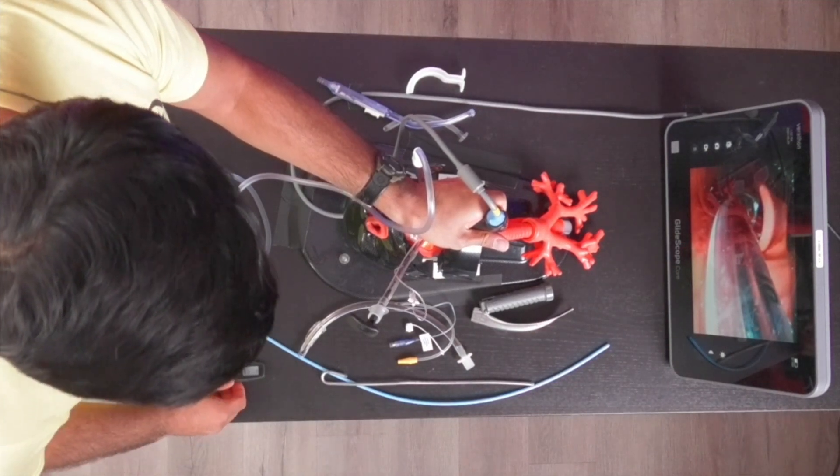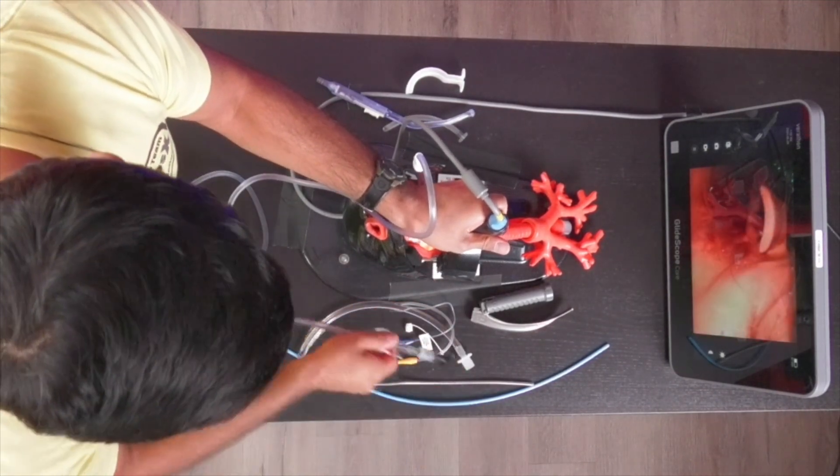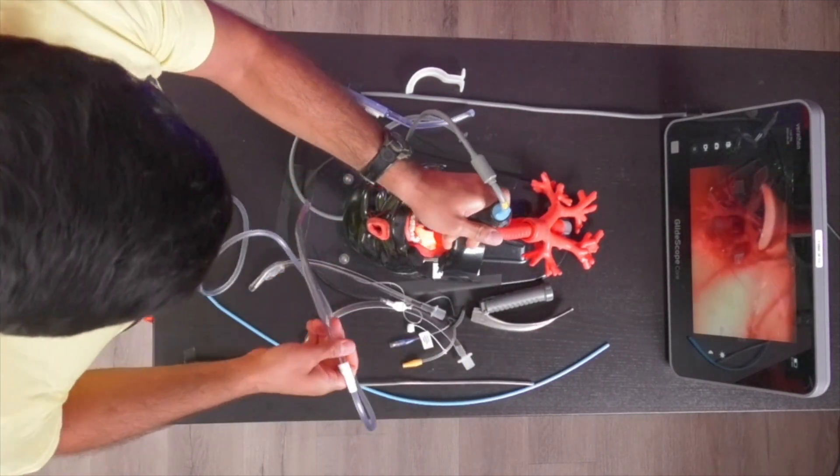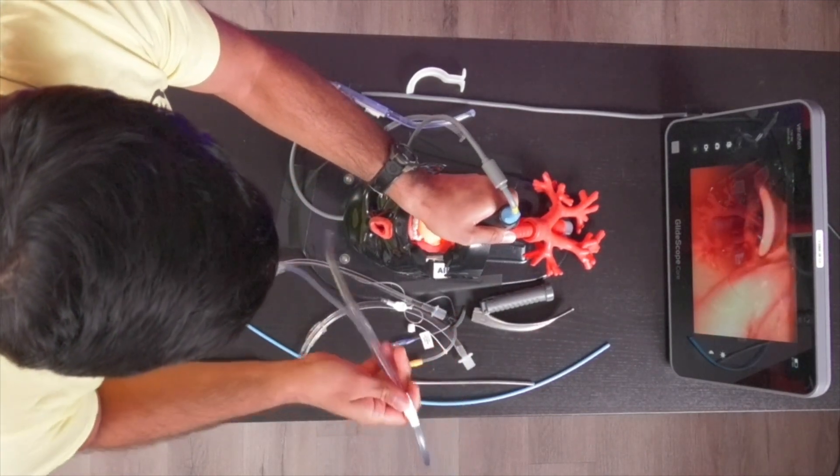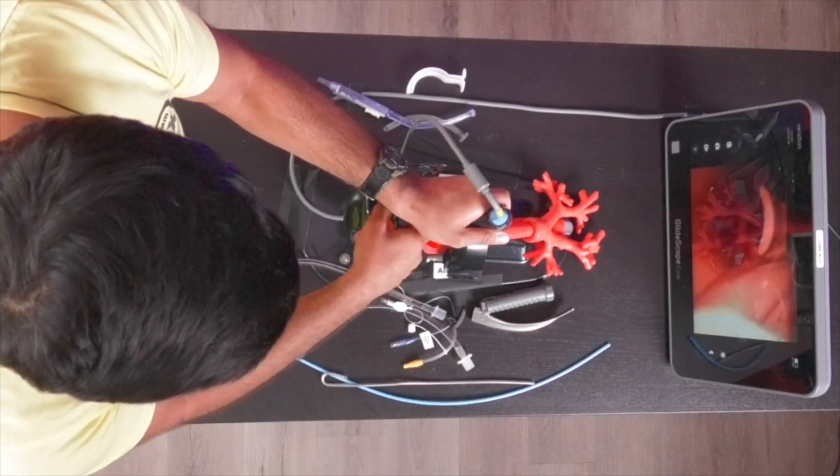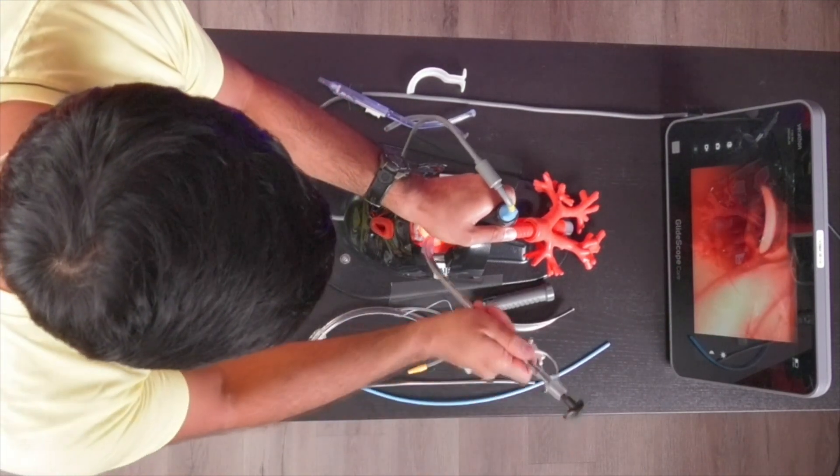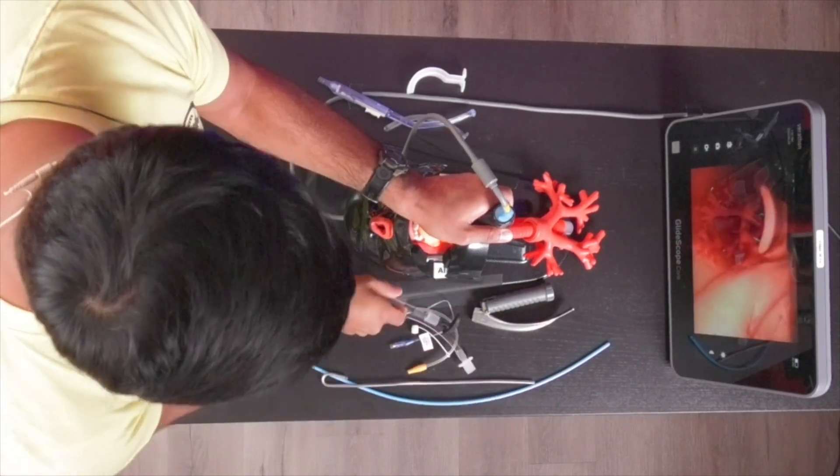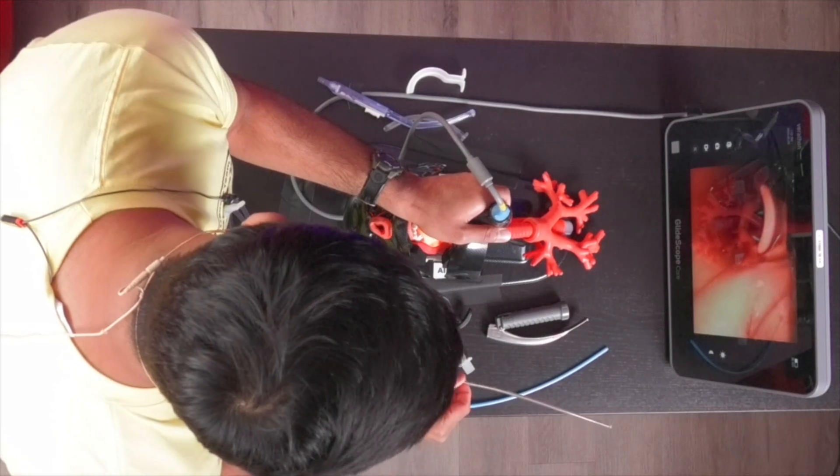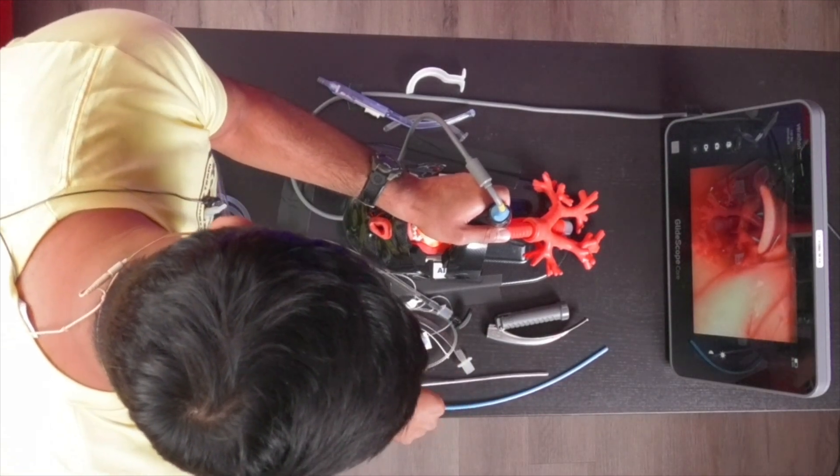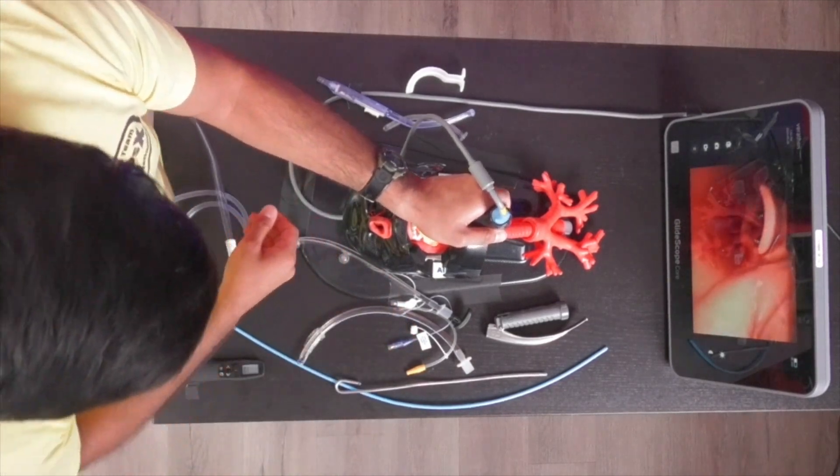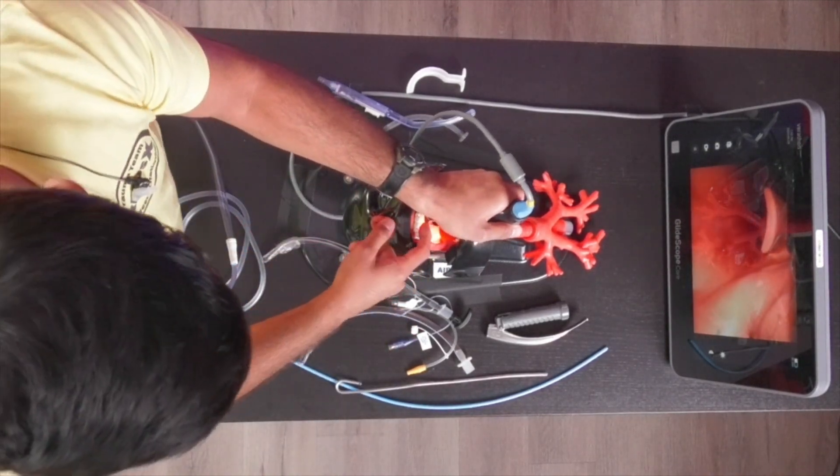There are actually a couple different methods we can use to intubate from this position. The first is just your standard intubation. We're using a hyper-angulated glidescope, so we can intubate just like this. If we're using a direct blade, we're going to use a corresponding malleable stylet bent at maybe 70 degrees. Some people like a hockey stick angle for intubation with a standard geometry blade.